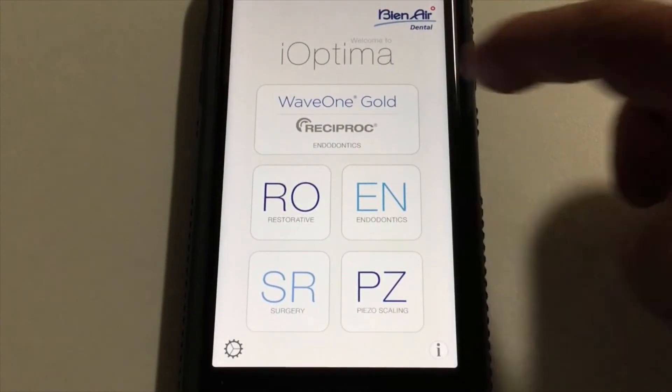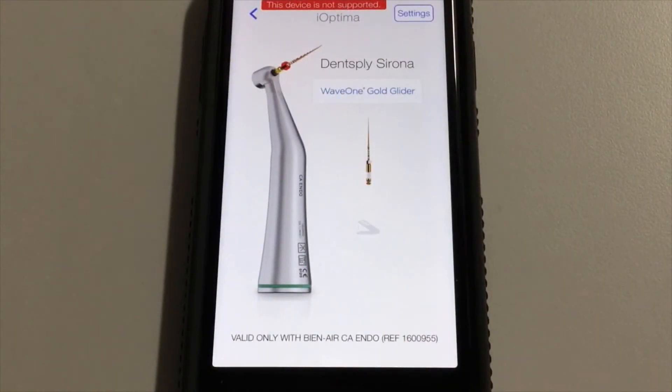The newest development with iOptima is Wave 1. B&Aire spent three years going through very rigorous testing with Dentsply Tulsa, and we are the only Dentsply Tulsa certified partner worldwide — a designation and partnership that we're very proud of. With Wave 1, when you put your endodontic handpiece on the motor and hit the foot control, it will automatically measure the torsional stress on the file, auto-forwarding and auto-reversing in that watch-winding motion based upon the resistance on the file. This is a very exciting development for many of our current users as well as those already putting it into their practice.